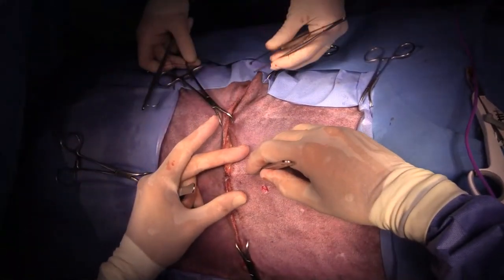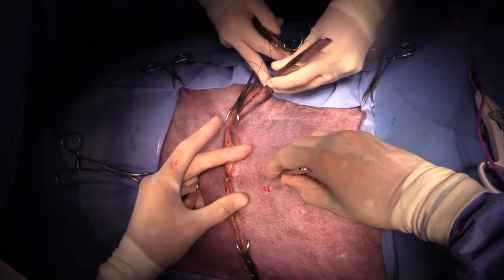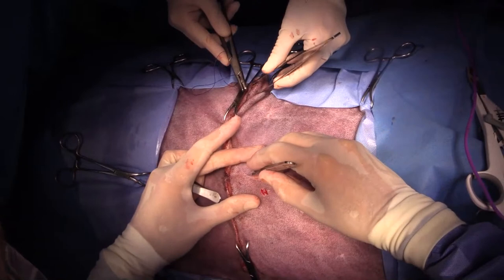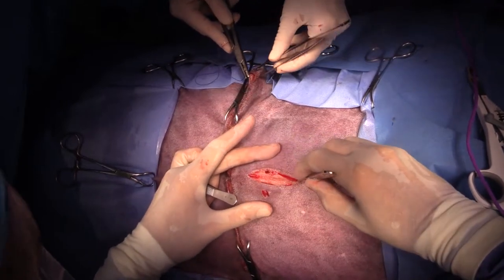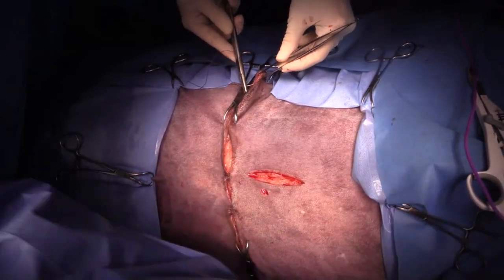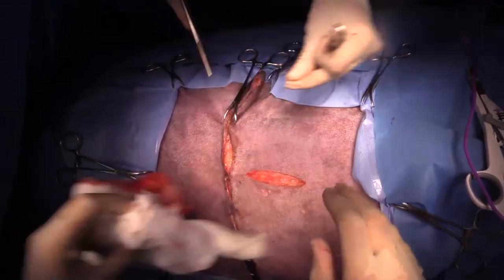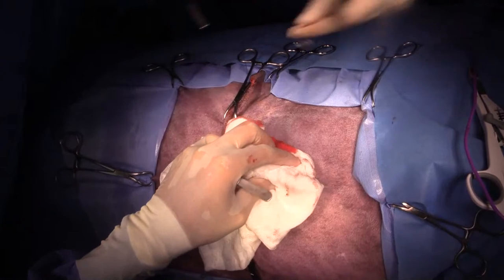And the horizontal portion, the middle portion of your Z, should be lined up along the lines of tension, like that. Can I get in another electric cautery, please? Yes. Thank you.